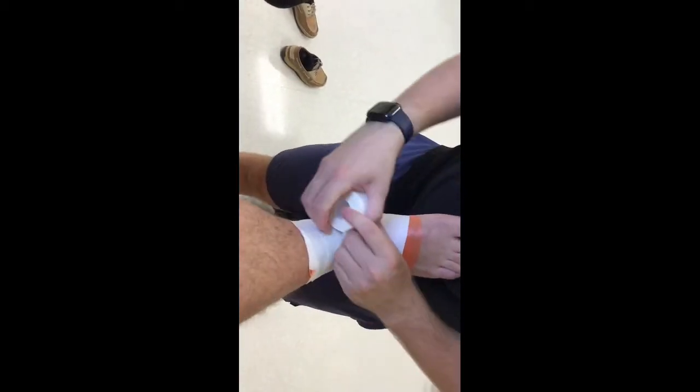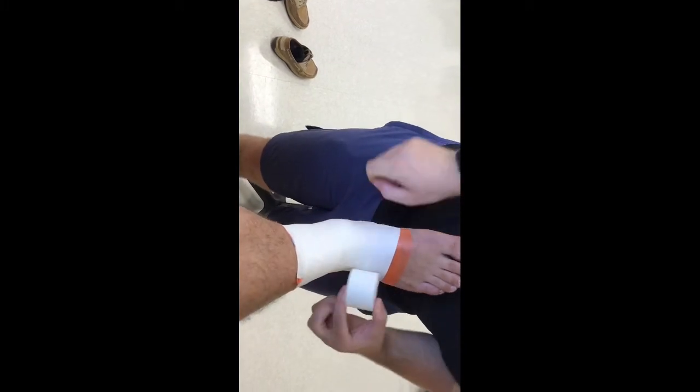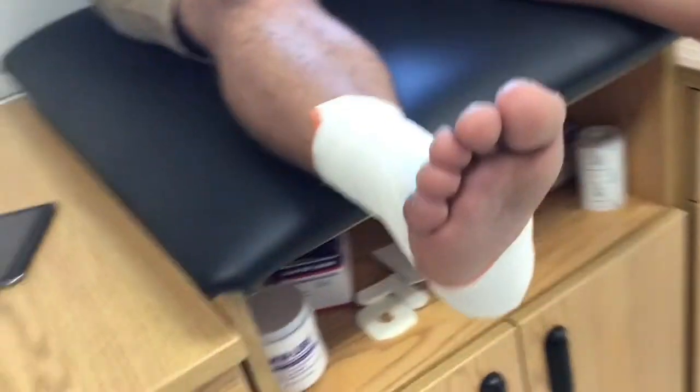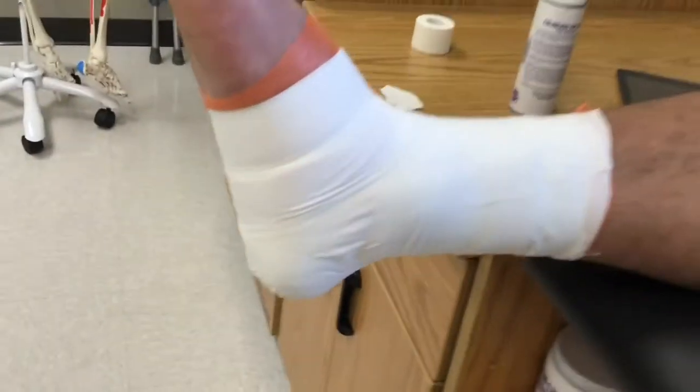So a couple of strips up top here. Again, remembering that that heel and lace pad is on the medial side of his foot. One more right here in the mid. And then he would be all good to go. Much cleaner. Ready?